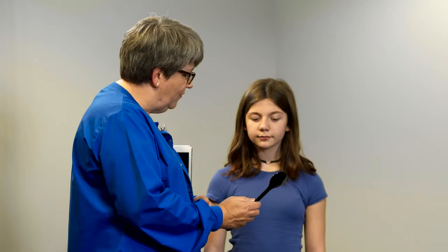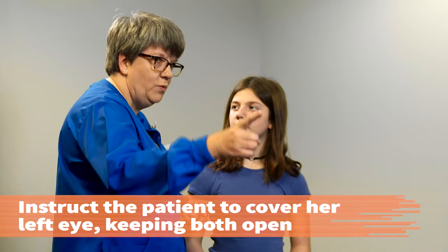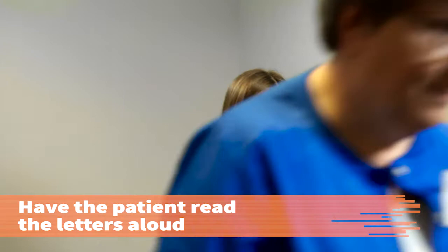All right, Jubilee, we're going to check your vision now. I'm going to have you use this occluder to cover one eye at a time, starting by covering your left eye. Traditionally, the right eye is tested first. Instruct the patient to cover the left eye with the occluder and to keep both eyes open throughout the test to prevent squinting.